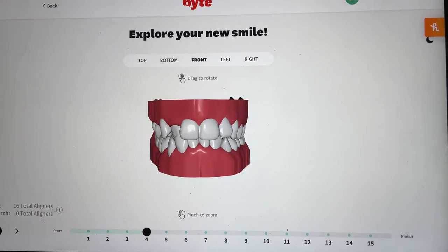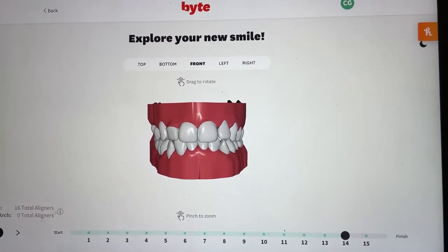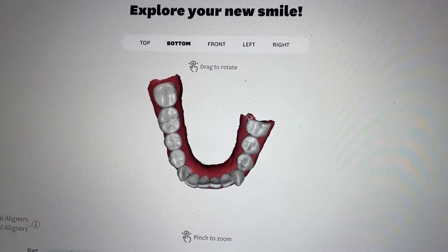I also wanted to show you all my journey on the Byte website. It gives you a virtual animated showing of how your teeth are moving with each individual step. I'm going to put up a graphic here so you can see what that looks like for my particular dental journey, including all of the dental history I was talking about with losing some teeth on this side of my mouth.